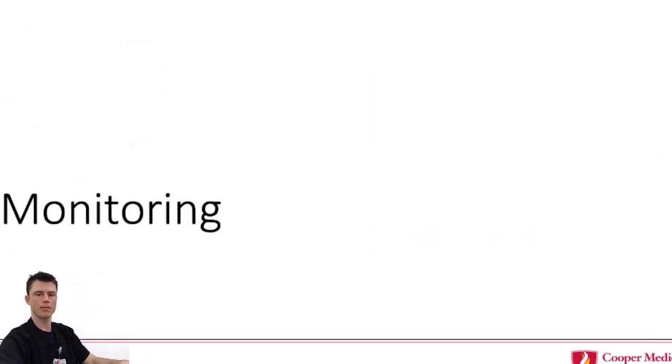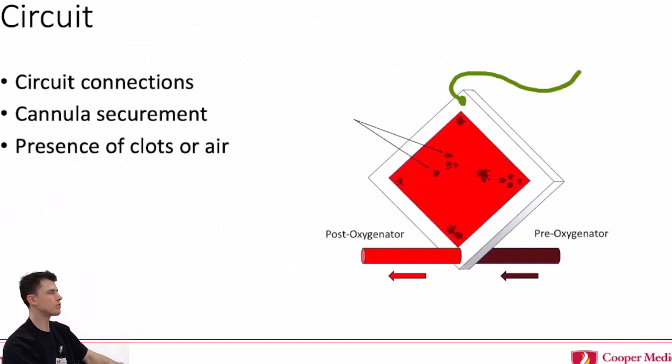All right, what about monitoring? So let's talk about the circuit. For those of you who manage the ECMO patients, this is where you're really familiar with our nursing safety checklist. Emily and Chris, and I'm forgetting who else, developed it. Me. Yes. So this helps us to remember all these things.